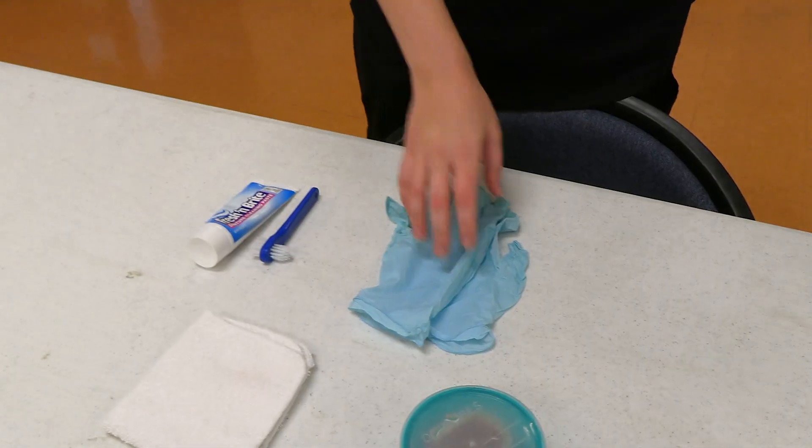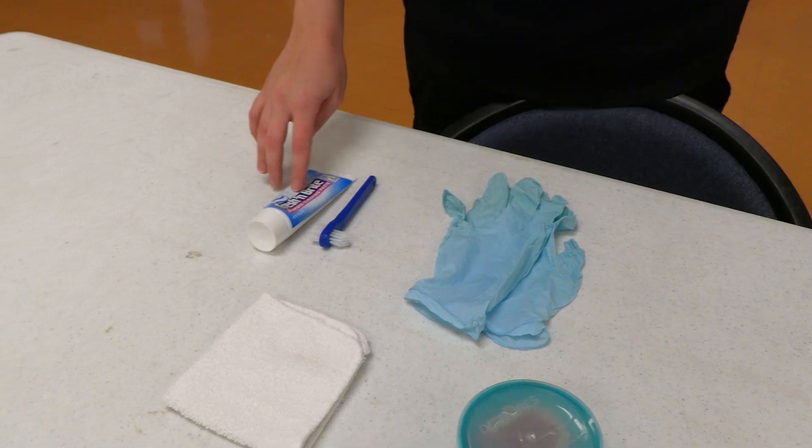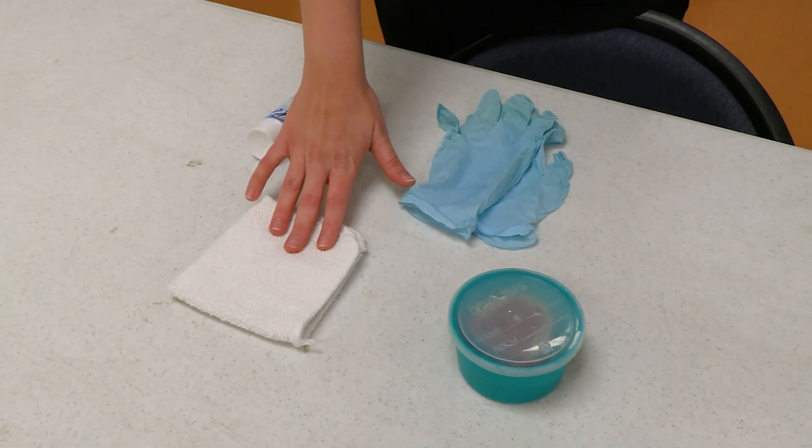The supplies you will need for this skill are a set of gloves, a denture brush, denture cleaning paste, a washcloth, dentures, and a wet laundry bin.